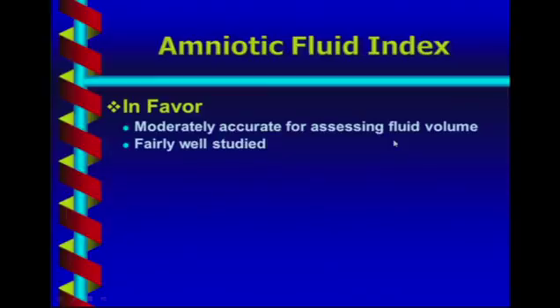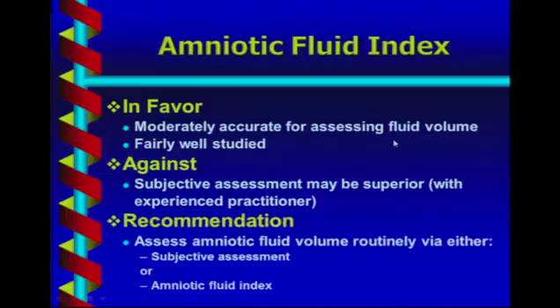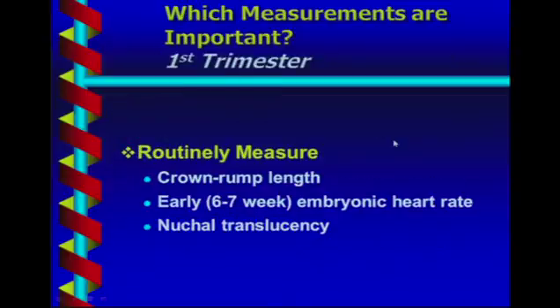So it's moderately accurate and fairly well studied, but against it is that subjective assessment may be as good or even better. In our facility we use subjective assessment. So always assess amniotic fluid volume, but it can be done either subjectively or via the amniotic fluid index.